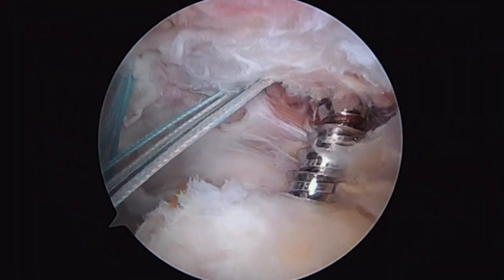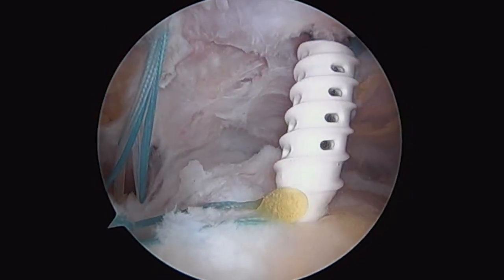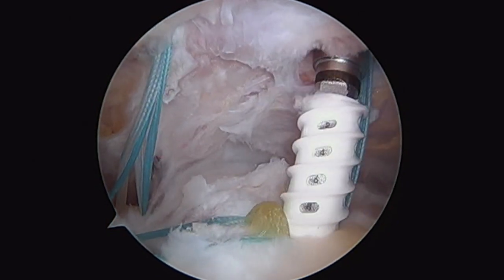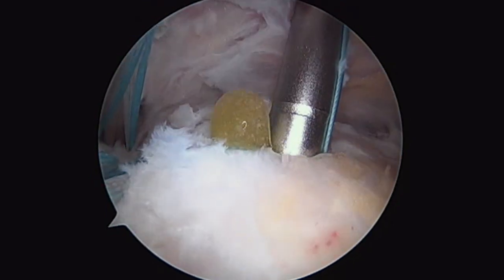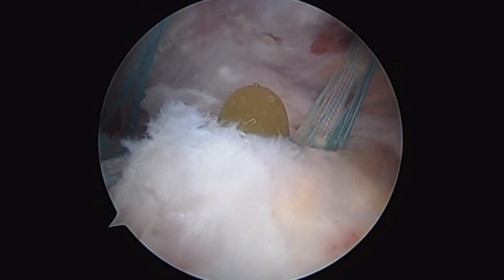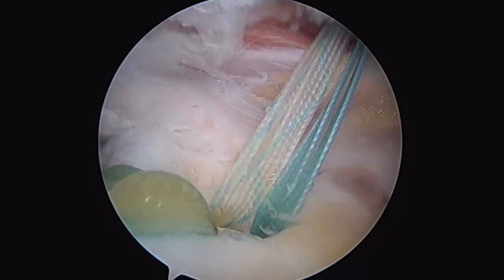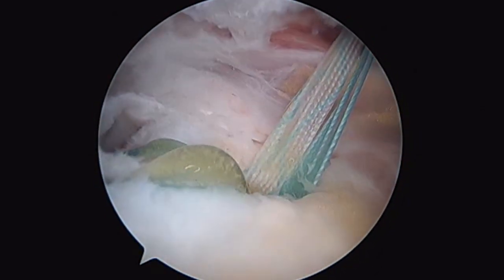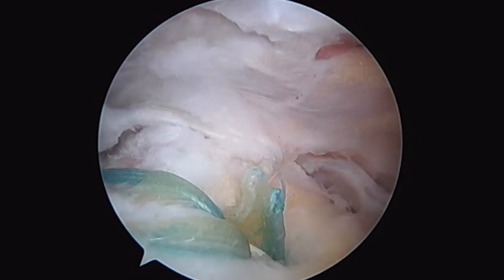This is our tap going in, which creates threads for our anchor. Once the anchor's in, you can see some of that bone marrow fatty looking tissue, which is what we want. That's this hollow architecture anchor — it allows bone marrow to leak out to help with healing of the cuff tissue. The last thing we do is cut the suture, which you can see there.